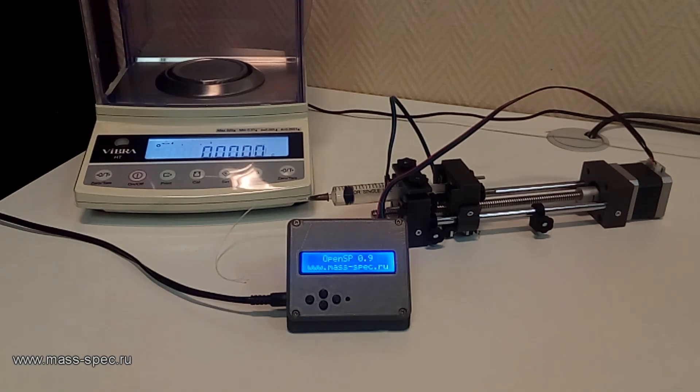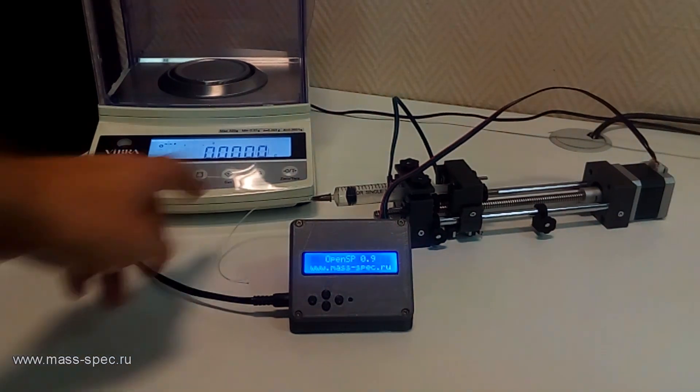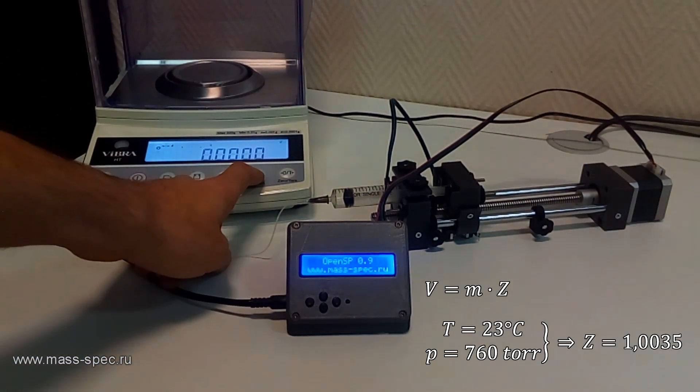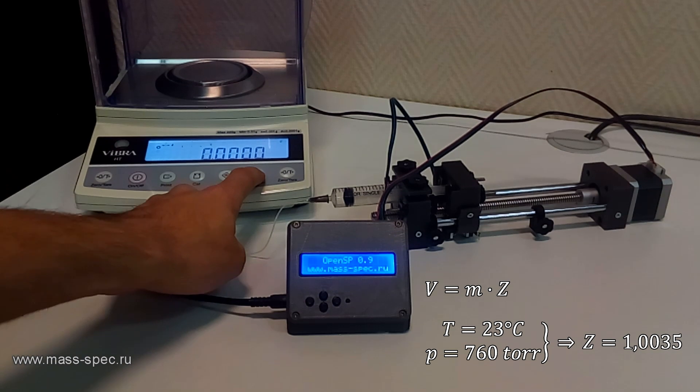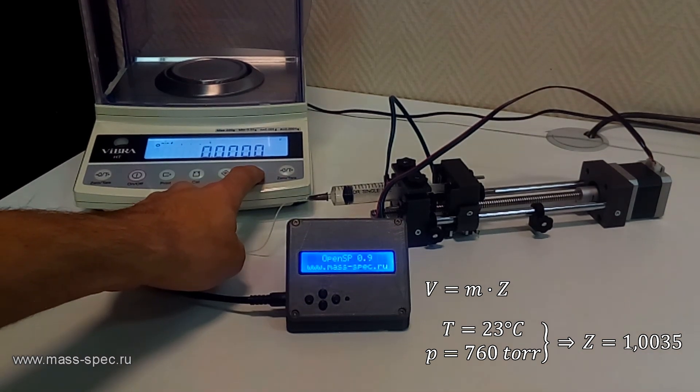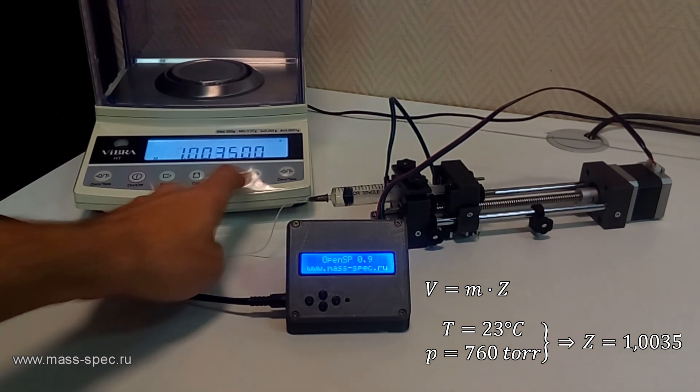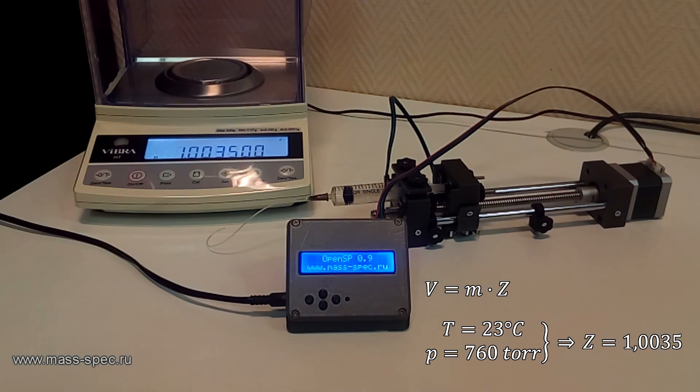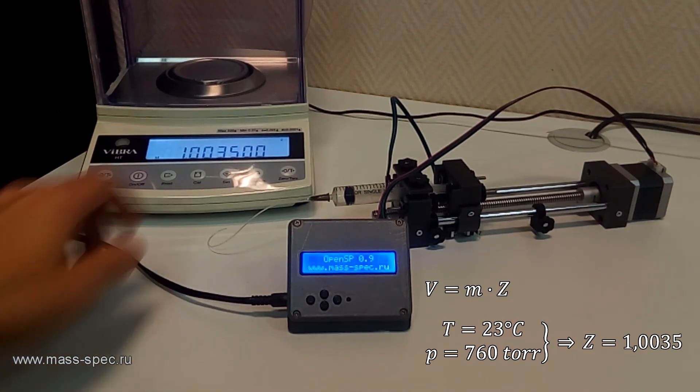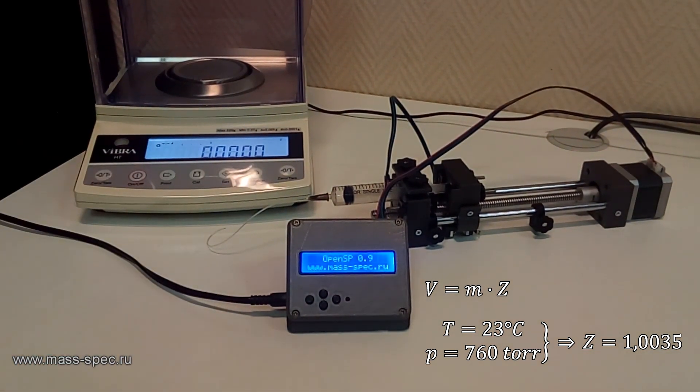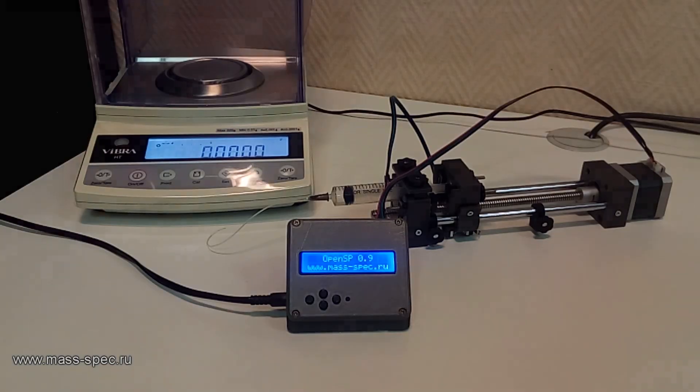Gravimetric calibration is typically used. This laboratory balance can calculate the volume by multiplying the measured weight by a correction factor, which is equal to 1.0035 at 23 degrees Celsius and 760 torr.